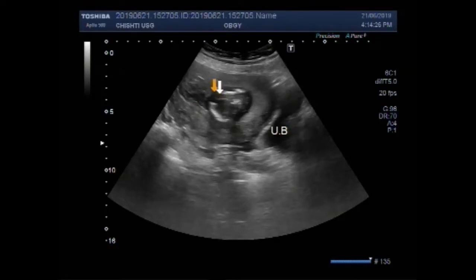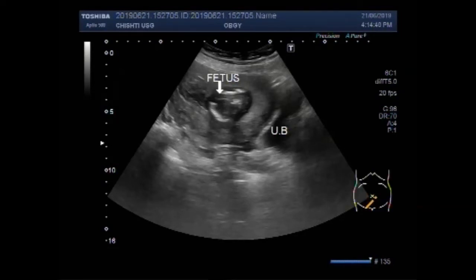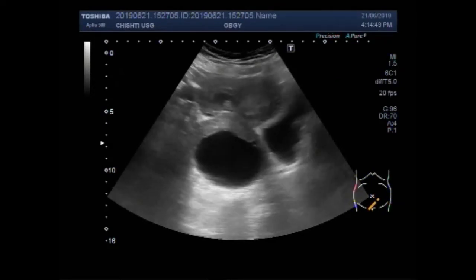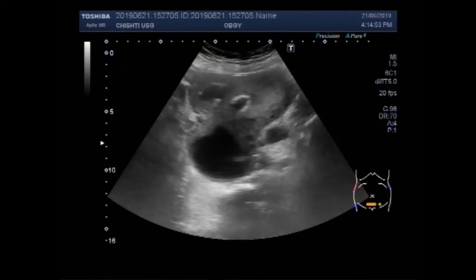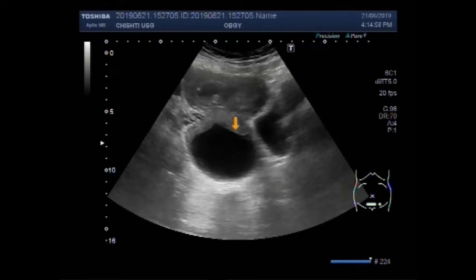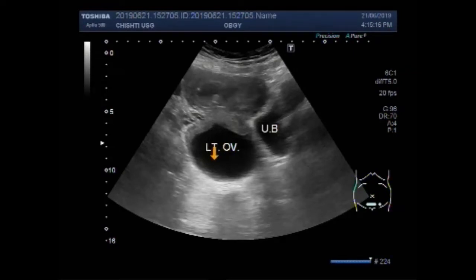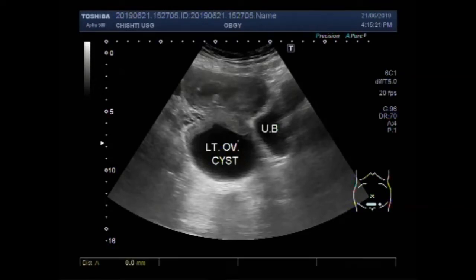This is the urinary bladder and this is the fetus. Now you can see the large left ovarian cyst. This is the urinary bladder and this is the large left ovarian cyst. The cyst has slightly turbid fluid in it, so possibly it is a hemorrhagic cyst.